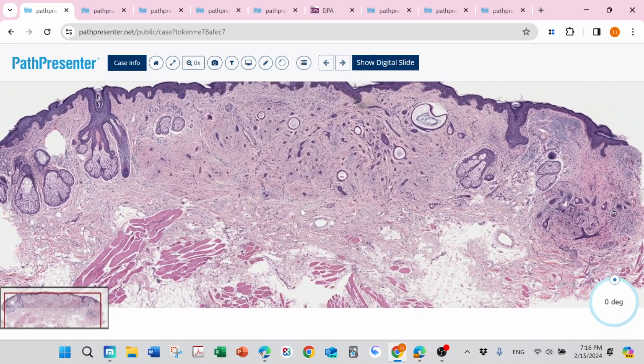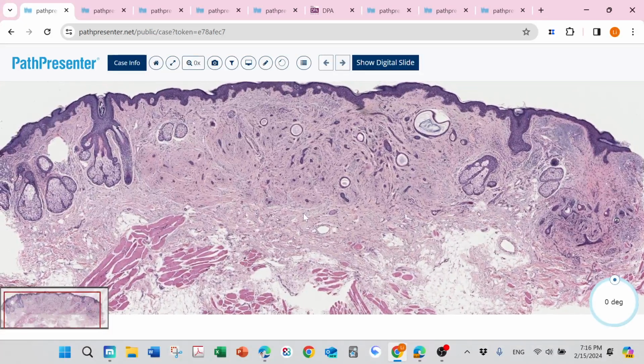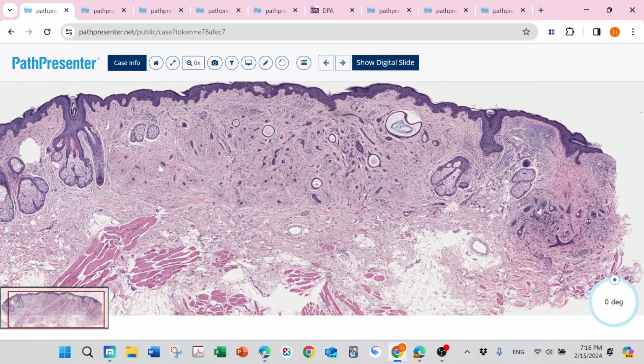But even like this, if you have this lesion, you still want to take it out because usually it's really broad shape and really not really to tell them apart. So this one, just for your information, desmoplastic trichoepithelioma is not similar to just trichoepithelioma.